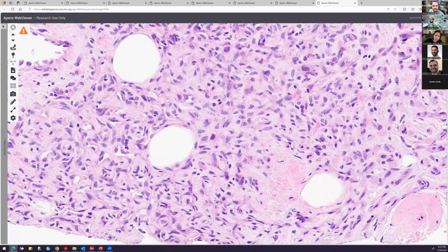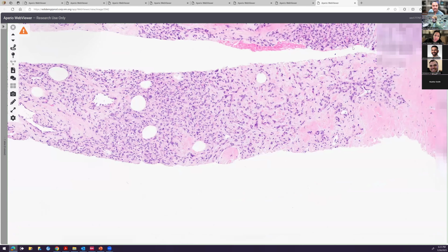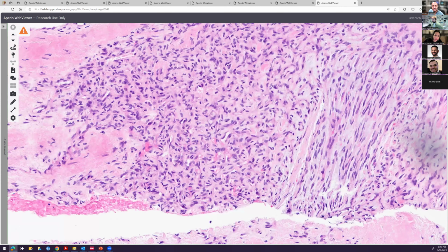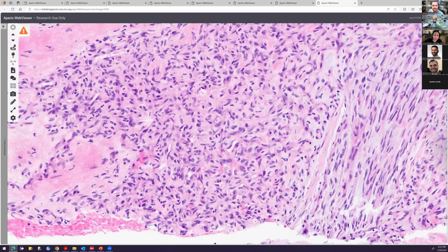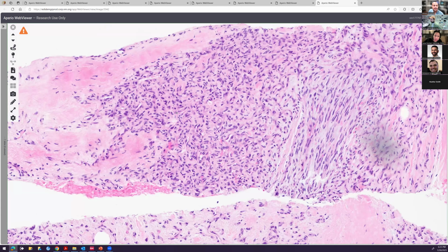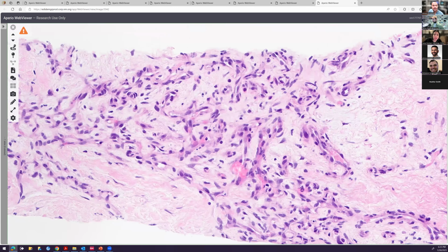Oh, okay. So this is the thing. This lesion generally has innumerable tiny thin-walled capillaries running throughout it, which is where this thing gets its name from. There can be some loose stromal cells in between. Okay. Does anyone know what this is? It's kind of a weird tumor. Yeah, I think it's angiofibroma of soft tissue. Yeah, exactly. It's an example of an angiofibroma of soft tissue.